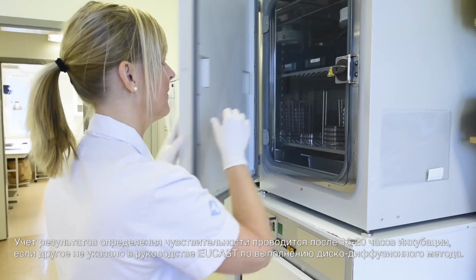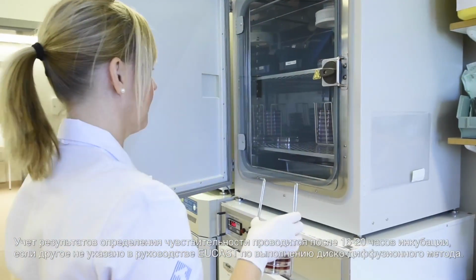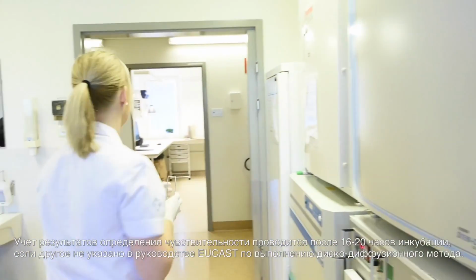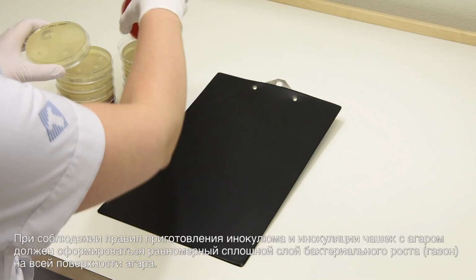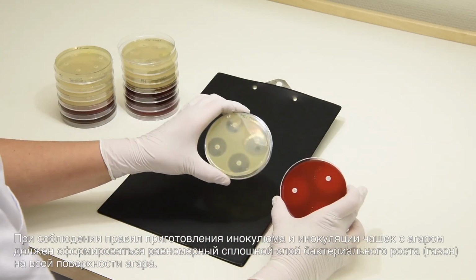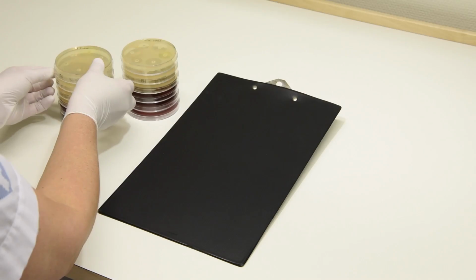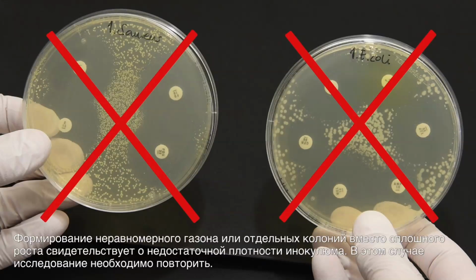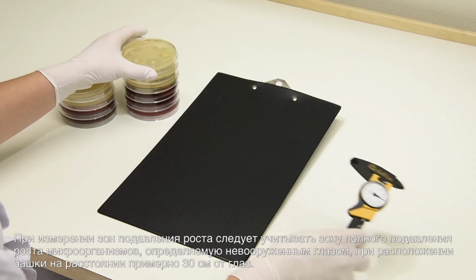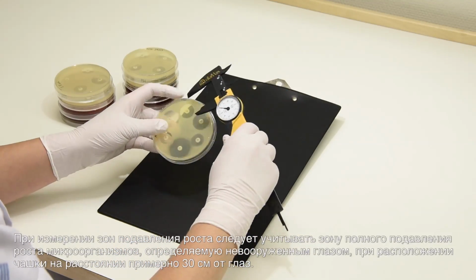Results from susceptibility testing are read after 16 to 20 hours of incubation unless otherwise stated in the EUCAST Disc Diffusion Manual. A correct inoculum and satisfactorily streaked plates should result in a confluent lawn of growth evenly distributed over the plate. If growth is semi-confluent or individual colonies can be seen, the inoculum is too light and the test should be repeated. Zone edges should be read at the point of complete inhibition of growth as judged by the naked eye, with the plate held about 30 cm from the eye.